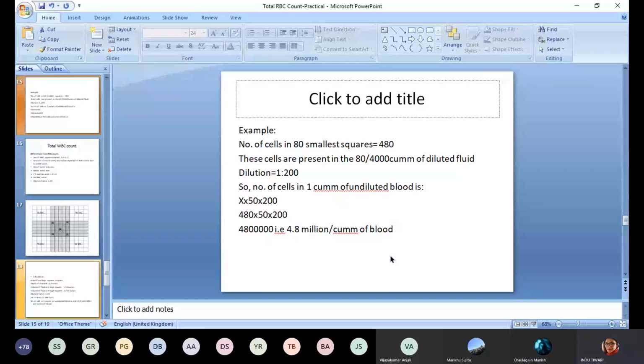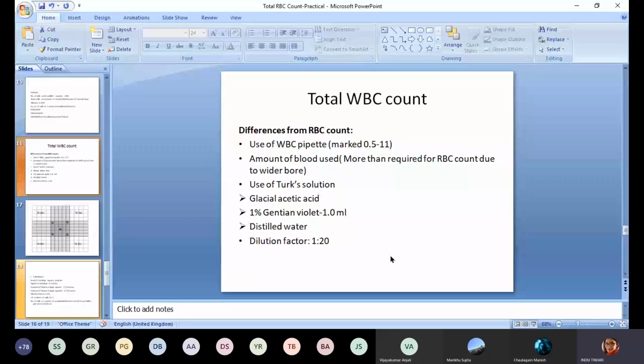Yes, ma'am. I hope you've understood. So this is how you're going to do the RBC count. I want you to watch a video right now, and then you will hopefully understand what it is about. Then again we will discuss how it is different from the counting of the white blood cells.